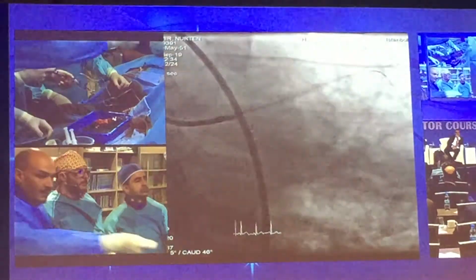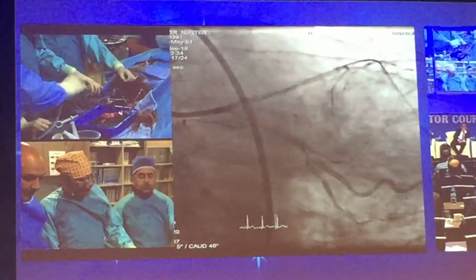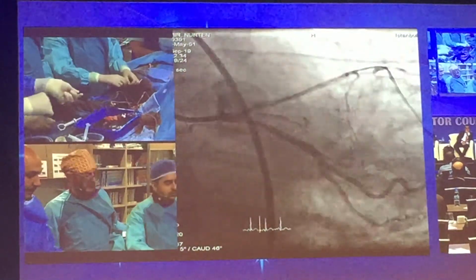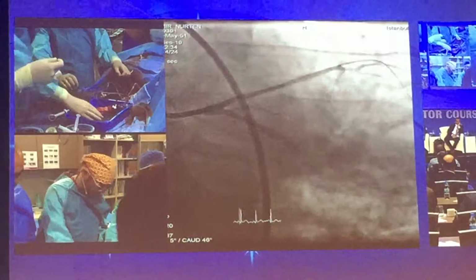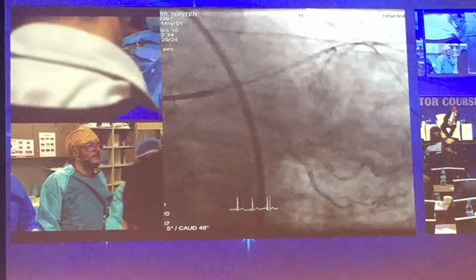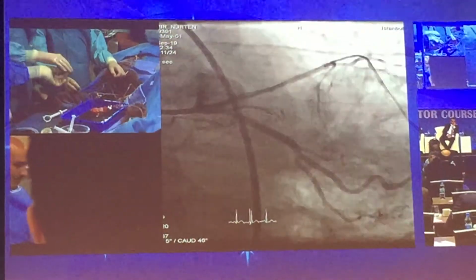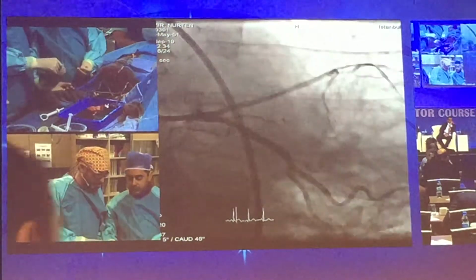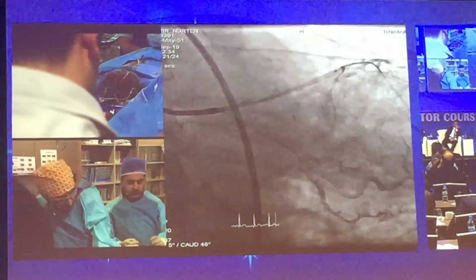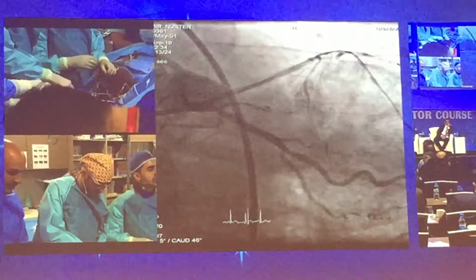Okay. Nihat, at this point you have started to deal with a LAD lesion which is very close to the LAD ostium, I think. Do you mind wiring the circumflex artery in terms of protection? You might have a complication, and I think you will stand down to the proximal ostial segment of the LAD. Do you mind protecting the circumflex artery at this point with a wire? I think there is enough segment in the LAD ostium.